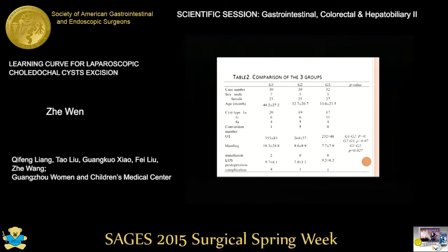We thought that the difference is because of the different indication criteria. In the early days of the training, only simple cases were selected for the candidates. Only when the technique matured did we perform the operation for all the patients admitted to our hospital without selection.